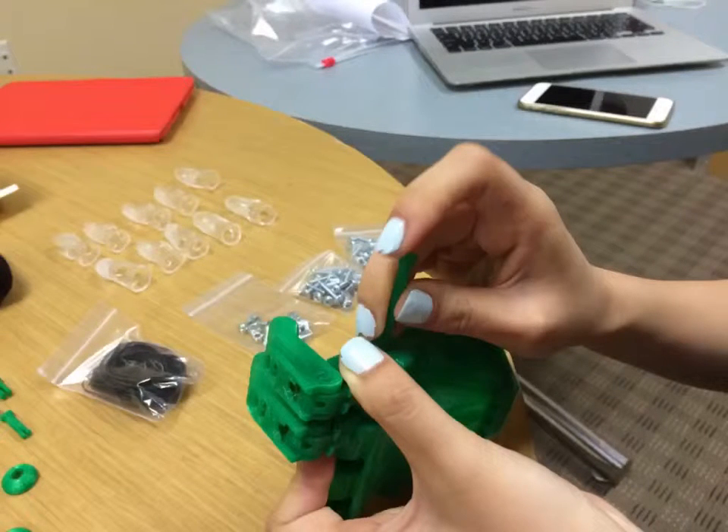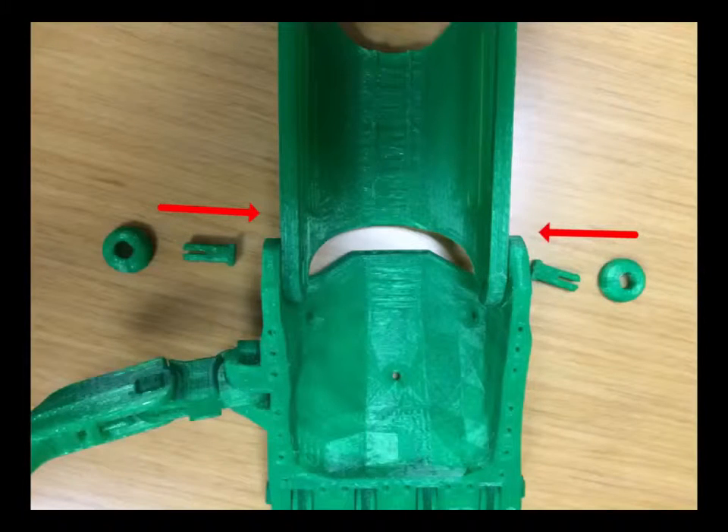Right after that, we went through a similar process to join the fingers with the palm. And once we joined together the palm and the gauntlet, you can see the basic shape of the hand.